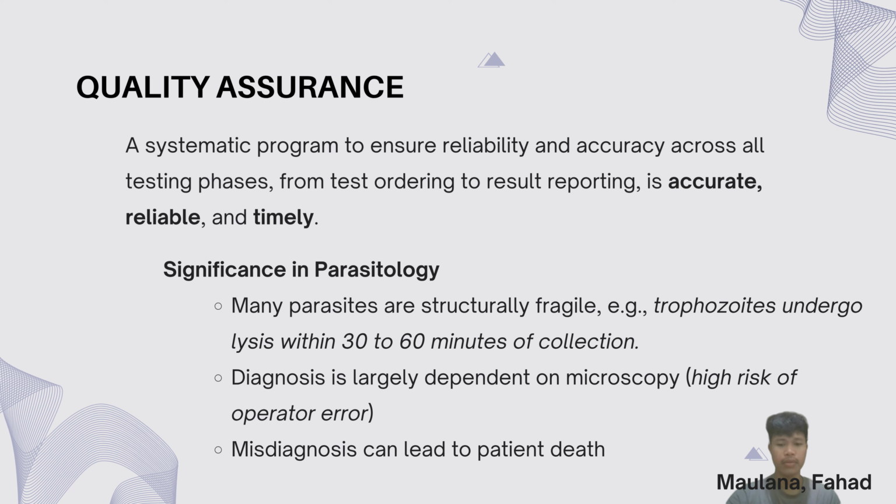To begin with, quality assurance is a systematic program designed to guarantee reliability across all testing phases. Now, why is QA especially significant in parasitology? First, many parasites are structurally fragile. For example, trophozoites can undergo lysis within just 30 to 60 minutes after collection.